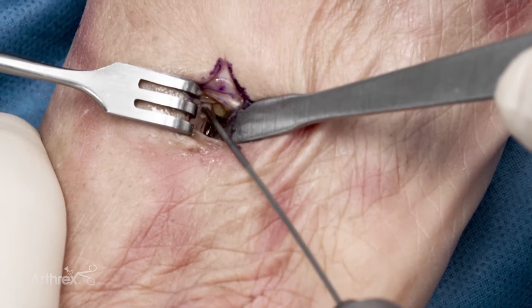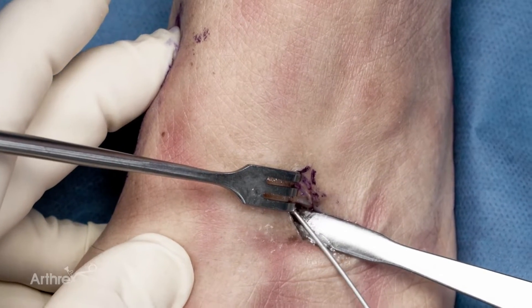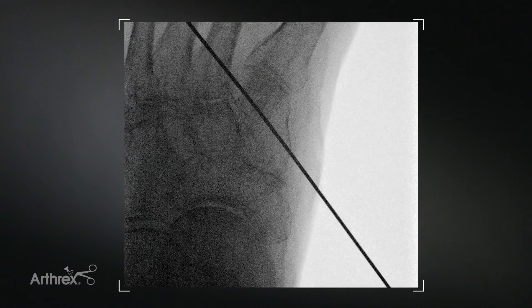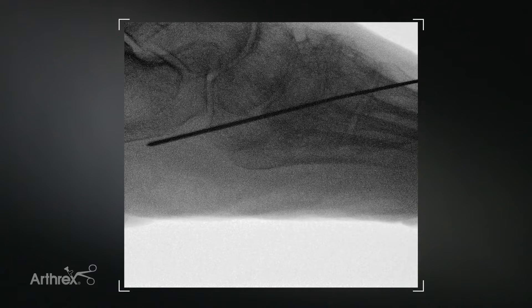I'm going to get it started on that cortex, angling so that I can come right out where my finger is. Then I'm going to look at it under x-ray. I'm looking to make sure that my pin is in the base of the second metatarsal and it's actually into the medial cuneiform. I'll then check a lateral view to make sure that where my pin exits it's not going to be on the plantar surface of the medial cuneiform nor on the dorsal surface. You'll see my pin exiting right about the middle of the medial cuneiform.